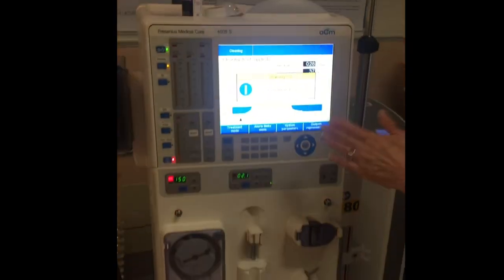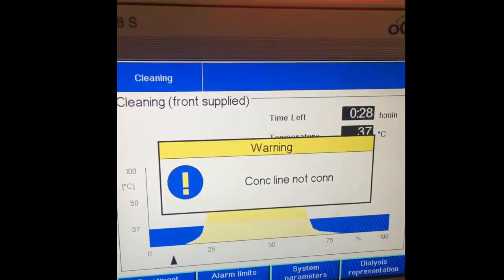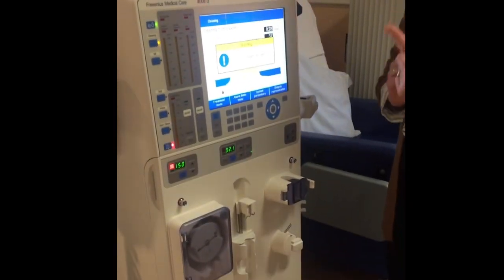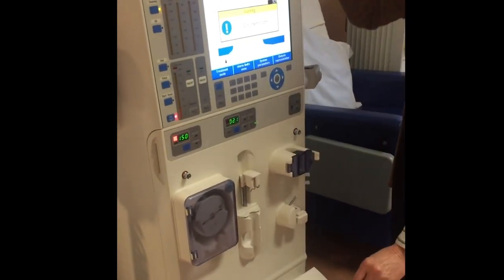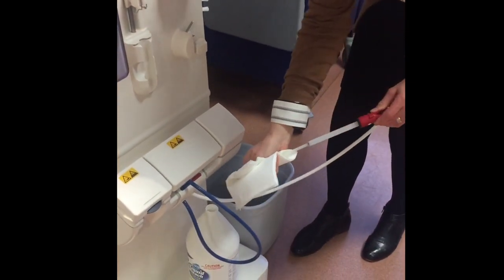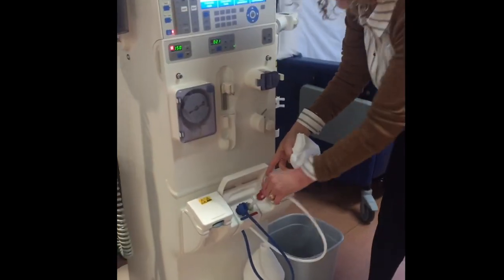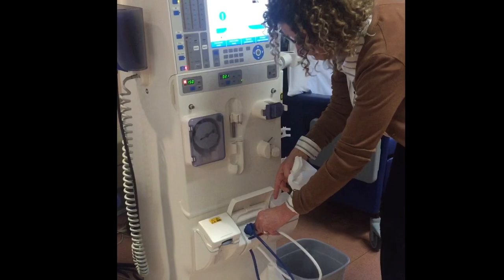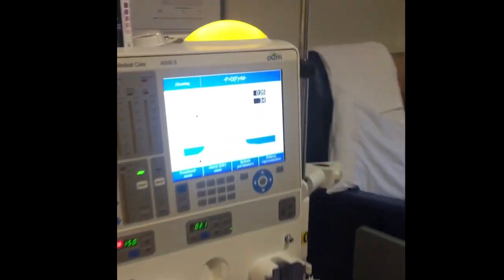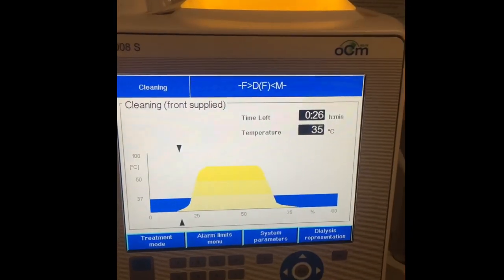It looks like it's finished. It's now saying 'Con-line Not Connected' — that's the message you'll get when it's picked up enough bleach. You'll also get that audible alarm as a reminder. Take the wand out, give it a wipe, and secure it. The machine has gone straight into cleaning and will finish in 26 minutes.